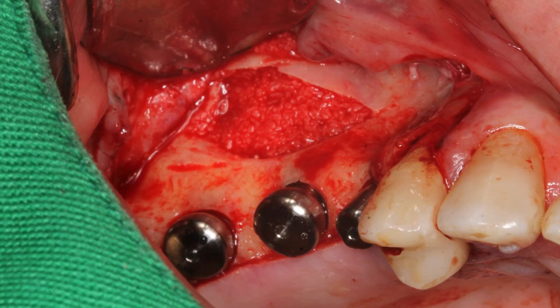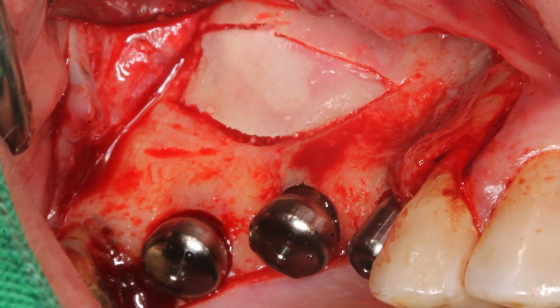This is the final view before we laid the replaceable bone window back, and it fits like a glove. It fits perfectly, which is very well executed. And then you realize that large void on the second bicuspid first molar area, the atrophy, possibly due to disuse or possibly due to some traumatic extraction in the past.